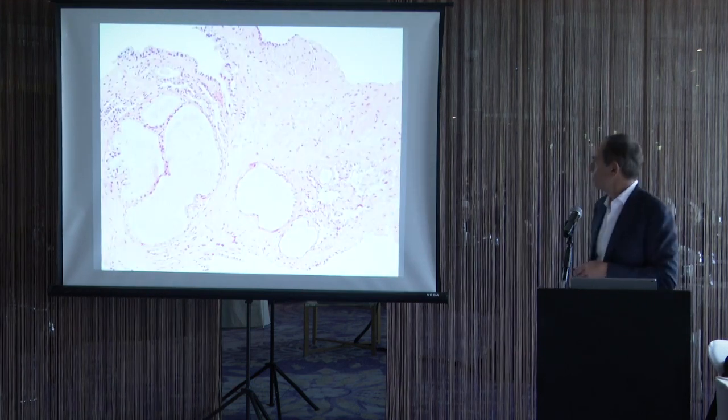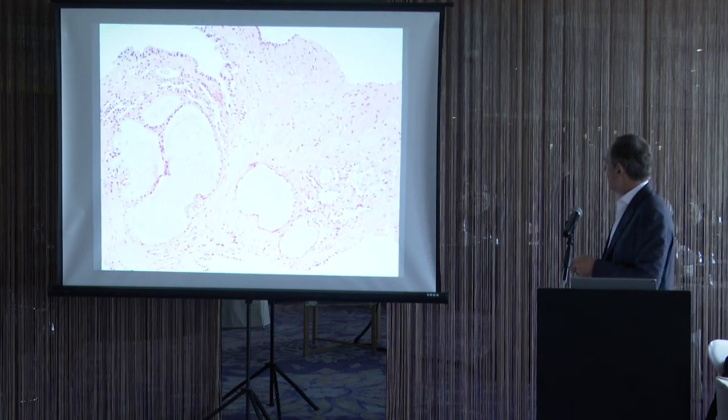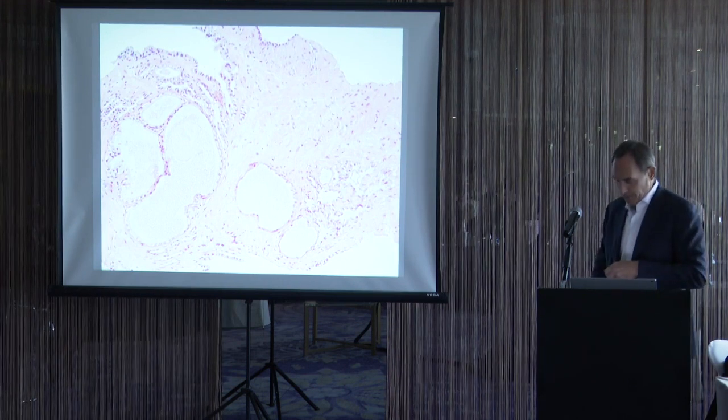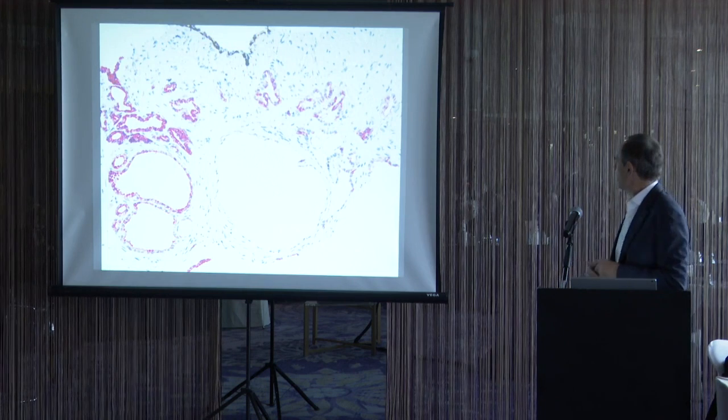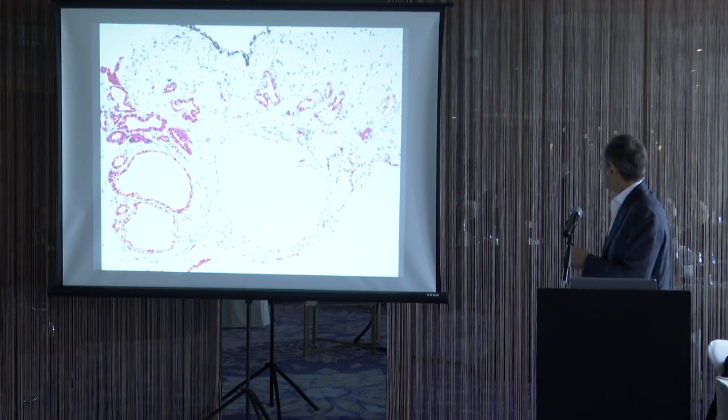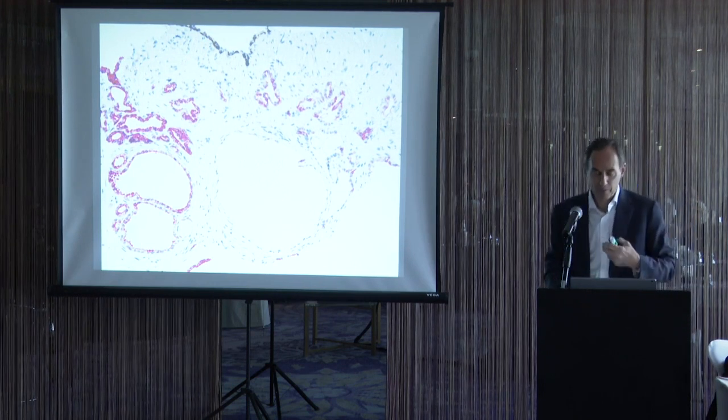Another case of partial atrophy, again, classic glands, large glands, infolding, totally benign. And again, stains like cancer. There's actually maybe one little basal cell here, but the rest negative. So again, it's a major pitfall.